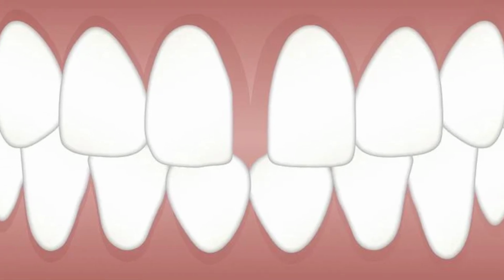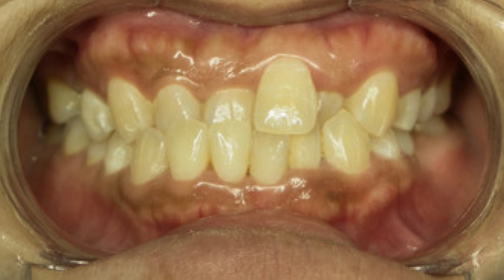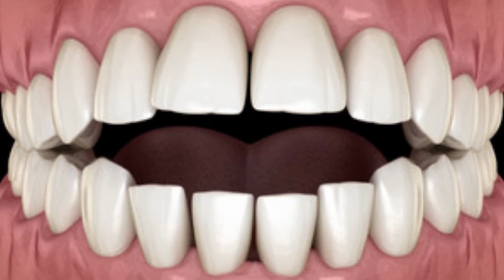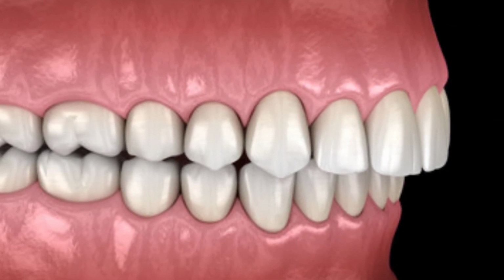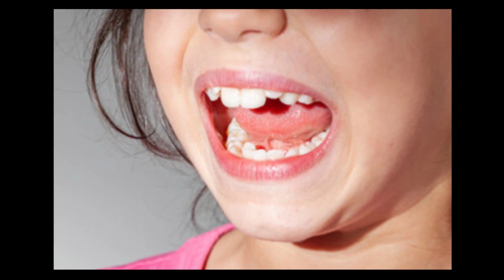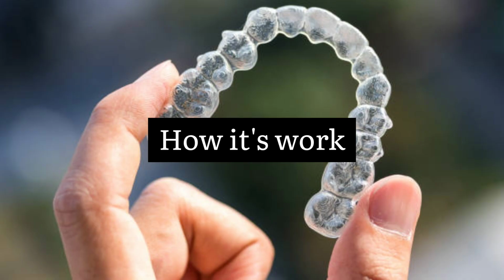Uses of clear aligners. Used to treat teeth gaps, crowding, and forwardly placed teeth. Used to treat crossbite, a condition when the upper teeth fit behind the lower teeth when your mouth is closed or at rest. Used to correct open bite, a condition when the upper and lower front teeth slant outward and do not touch when the mouth is closed. Correction of overbite, which occurs when the upper front teeth excessively overlap the lower front teeth when the mouth is closed. It is also used to correct misaligned primary or baby teeth of children between 6 and 10 years of age.